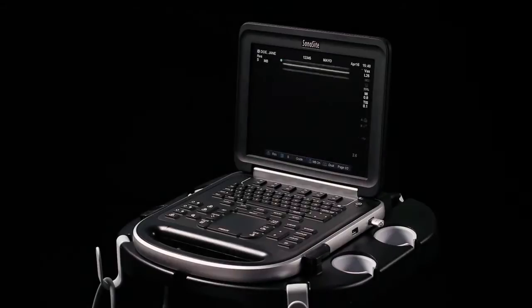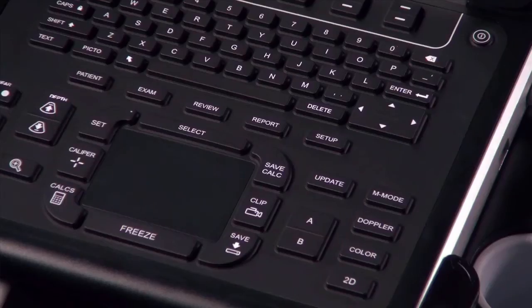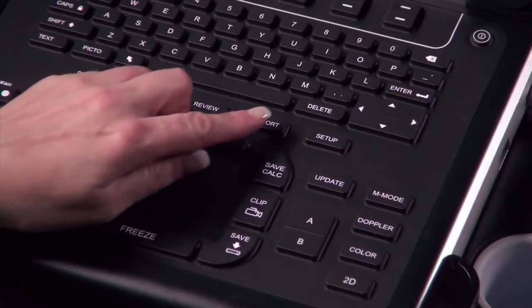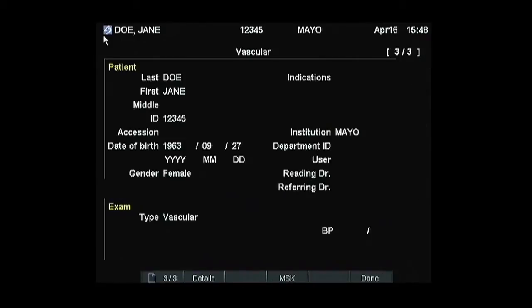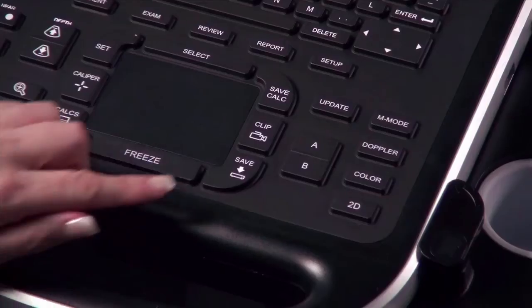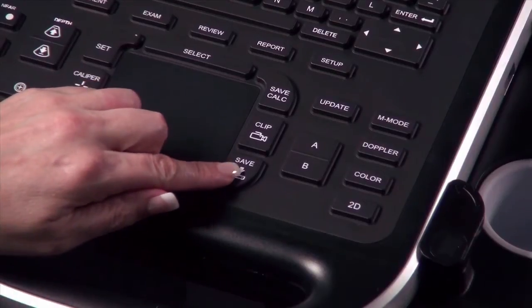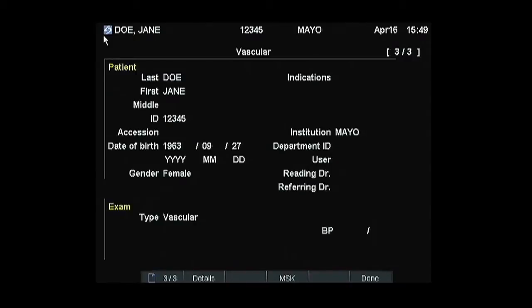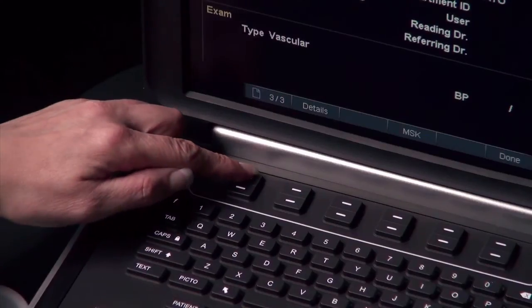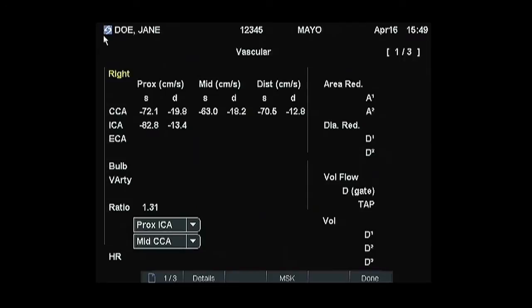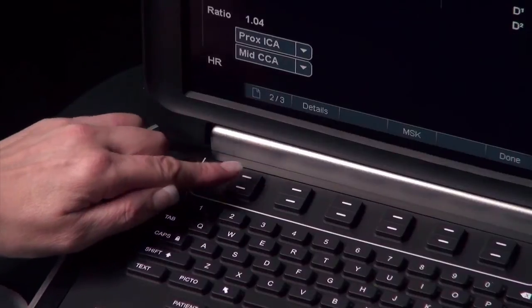To view a report of all patient data and measurements, select the Report key. This information can be saved with a patient exam by pressing the Save key. Each page of the report can be viewed by pressing the next key in the on-screen menu. Save each page of the report to include with the patient exam information.